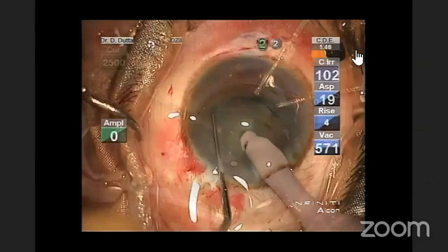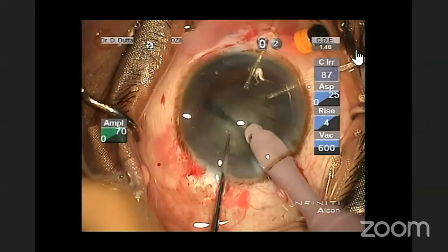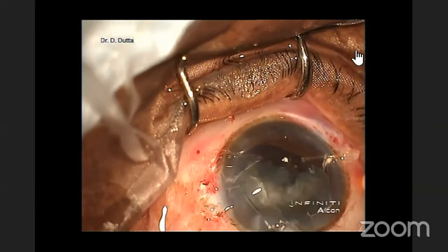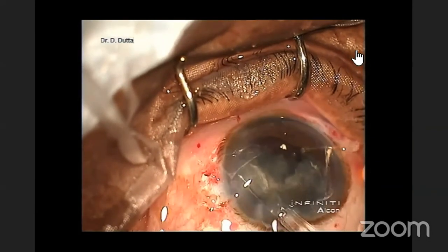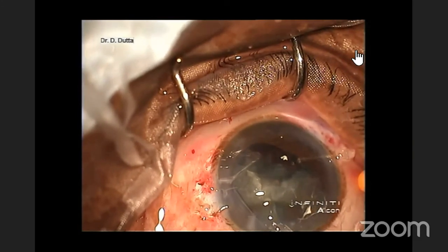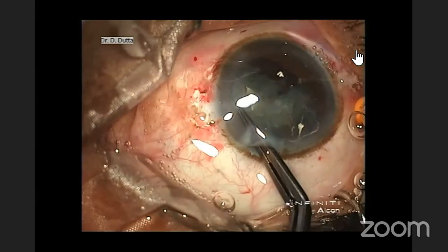The nucleus is divided by direct chop. I am removing the nucleus by phacoemulsification. Now that some nuclear mass has been removed and the bag seems unstable, I think it is high time to support the capsular bag by a CTR. The CTR is carefully placed in the bag.